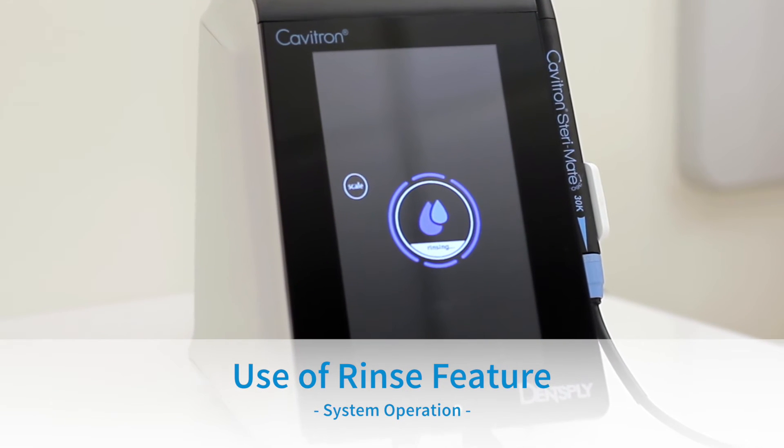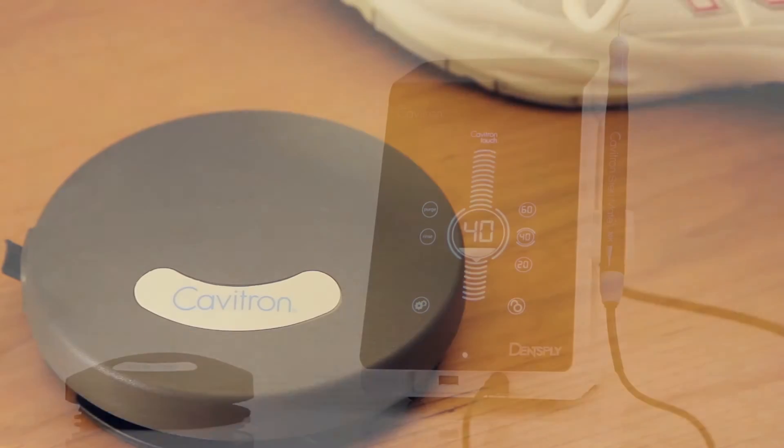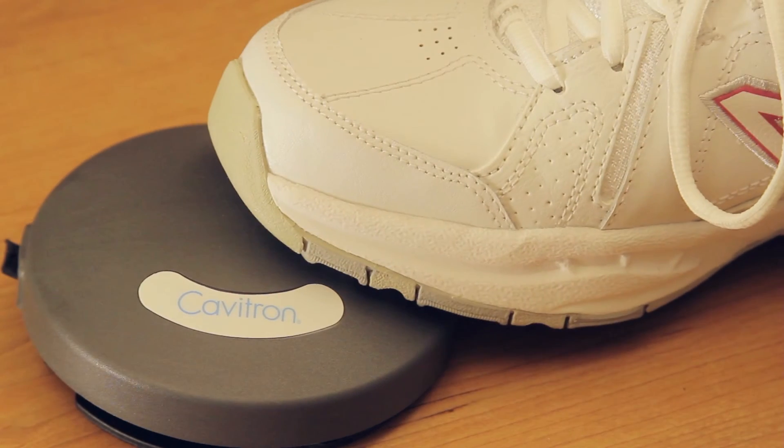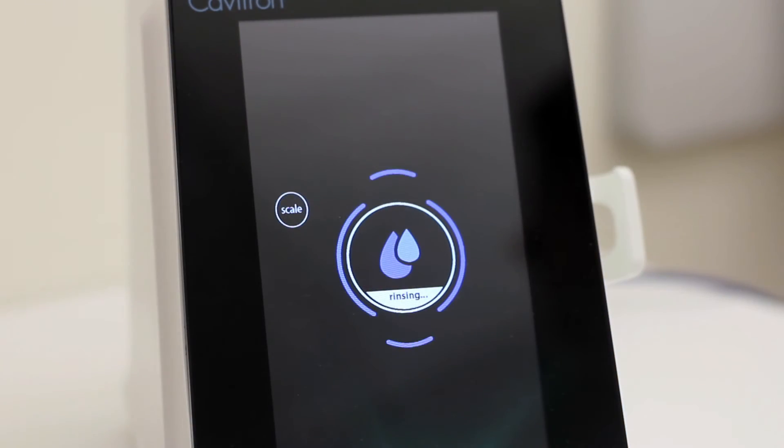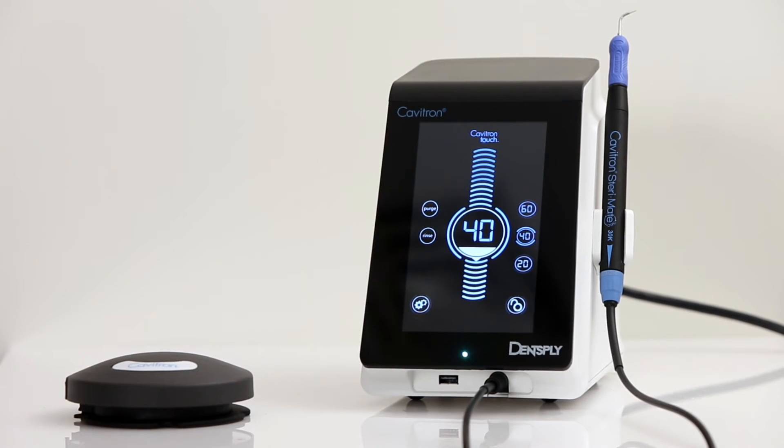Use of Rinse Feature. Users will operate this feature during an ultrasonic scaling procedure when lavage is desired with no cavitation. To use, press and hold the foot pedal for rinse mode cycle. To exit rinse mode, press the scale button to return to the main screen.